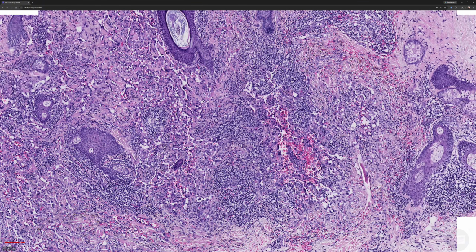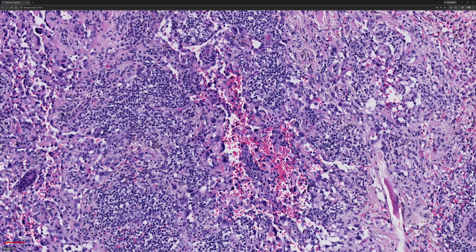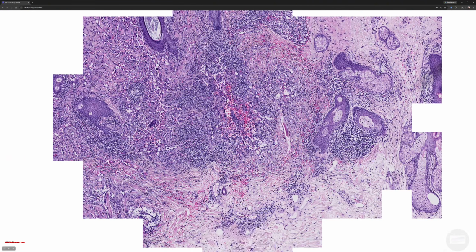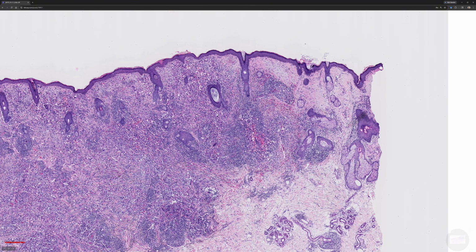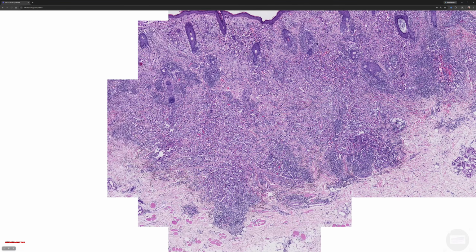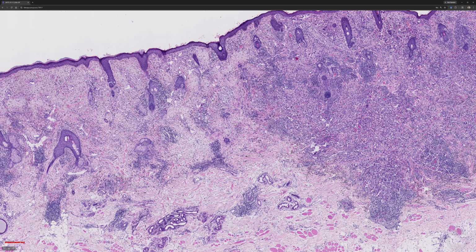And often angiosarc has a lot of background inflammation around it, okay, and that's what we're seeing here. There's often hemorrhage, there's often hemosiderin, and the classic place that I see these most often is on the head and neck of sun-damaged older adults, scalp or face of older adults. Even compared to other sun-damaged sites, by far it is more common in the head and neck. Even the dorsal arm and dorsal hand get tons of sun damage, but I almost never see angiosarcoma there. Why? I don't know. Something different about the vessels in the head and neck. I don't understand why that is.